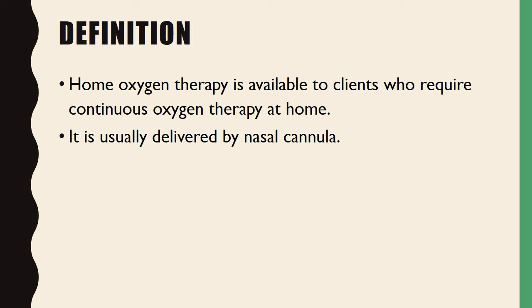So what do we mean by home oxygen therapy? From the words itself you can identify it: as a treatment, we are giving oxygen in a home atmosphere. Home oxygen therapy is available to clients who require continuous oxygen therapy at home, with no need of staying in the hospital.